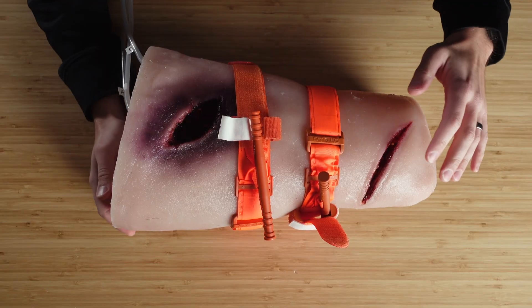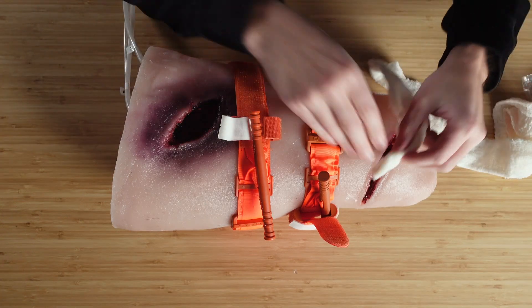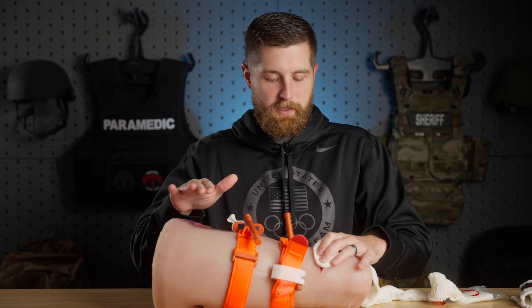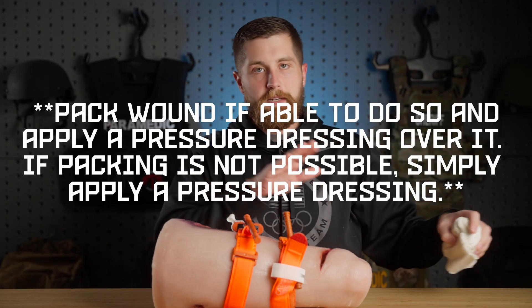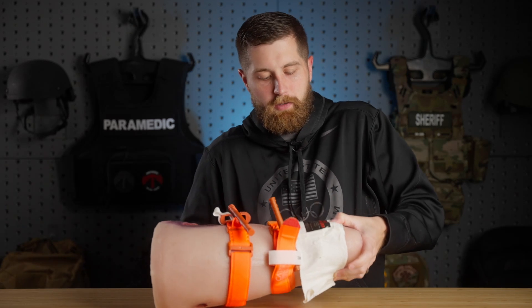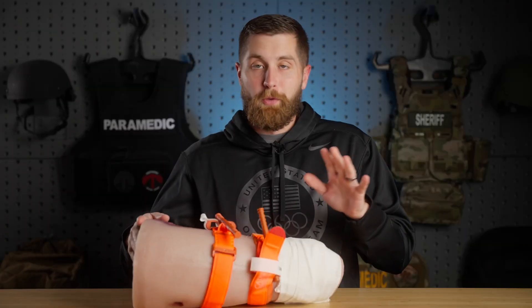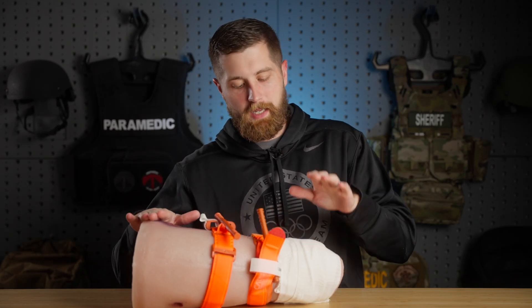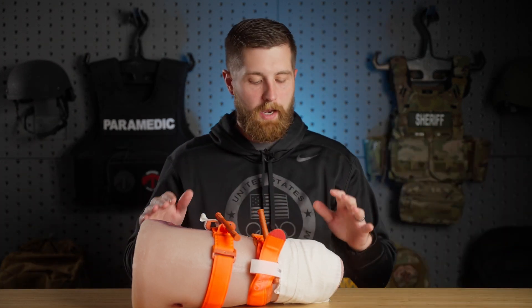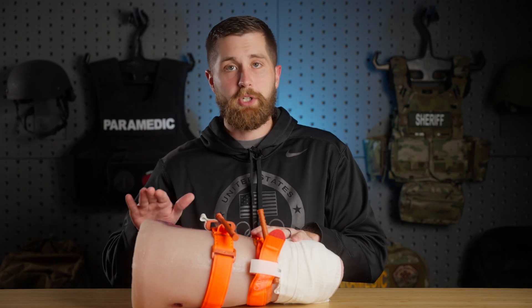The next thing I'm going to do is look at the wound. If it's a cavitated wound that needs packing, I'm going to take hemostatic gauze — this is just normal gauze here for demonstration — and pack that wound as much as I can. If it's not amenable to packing, we're going to take a pressure bandage and wrap the wound as well as we can. We want to keep this in place for at least three minutes before we try to do anything — that gives the hemostatic agent time to work and solidifies whatever clots are in the wound. So we have both tourniquets in place and we're ready to go just in case something fails.